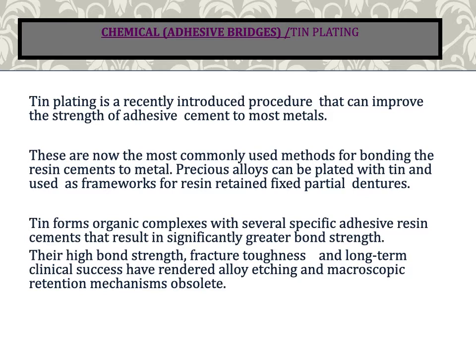Precious alloys can be plated with tin and used as frameworks for resin-retained fixed partial dentures. Tin forms organic complexes with several specific adhesive resin cements that result in significantly greater bond strength. Their high bond strength, fracture toughness, and long-term clinical success have rendered alloy etching and macroscopic retention mechanisms obsolete.